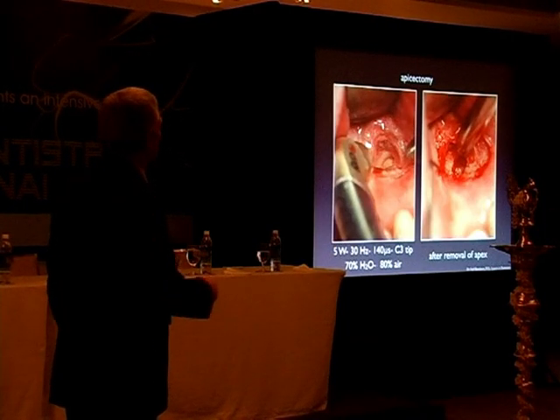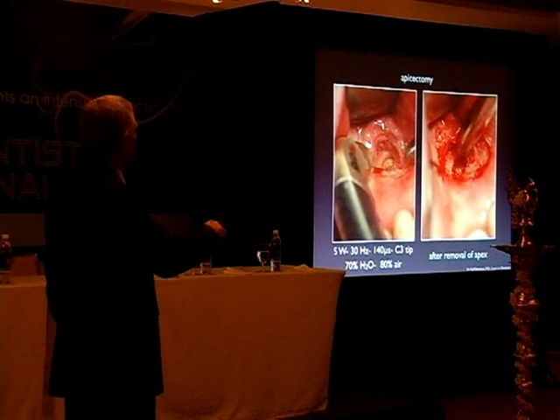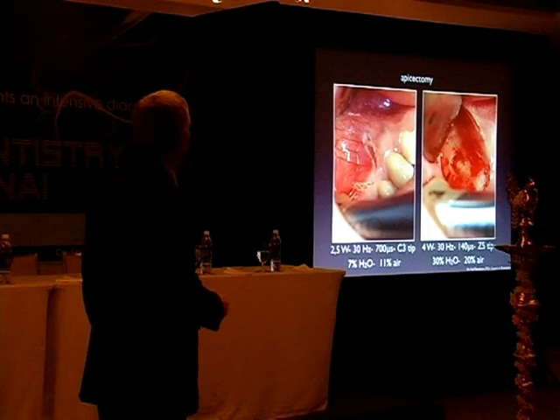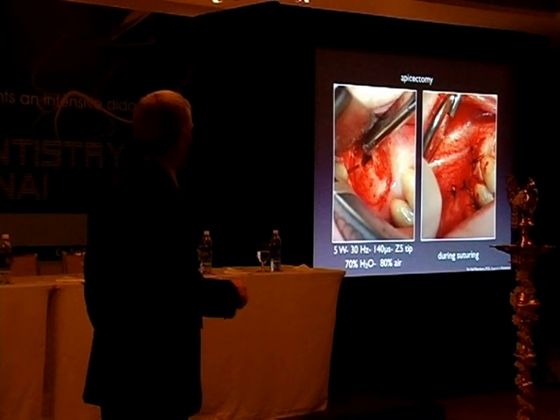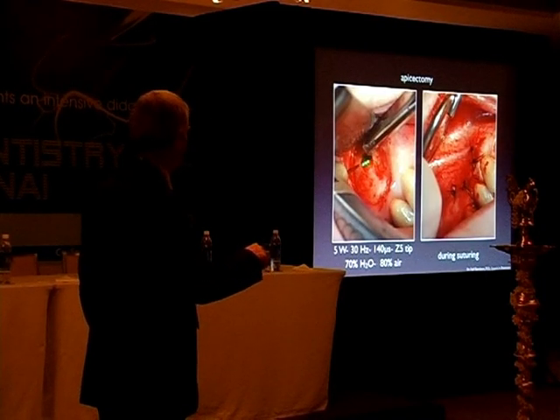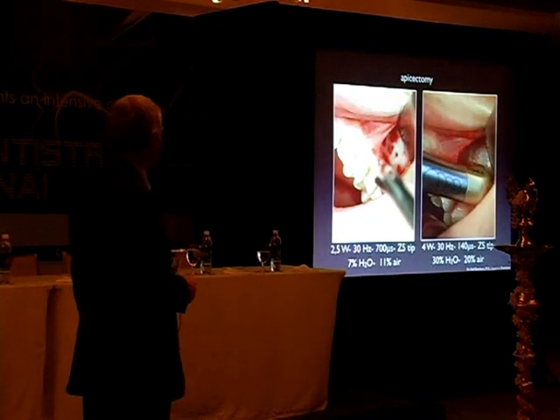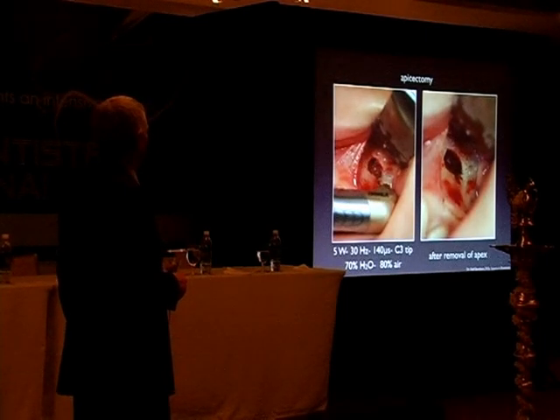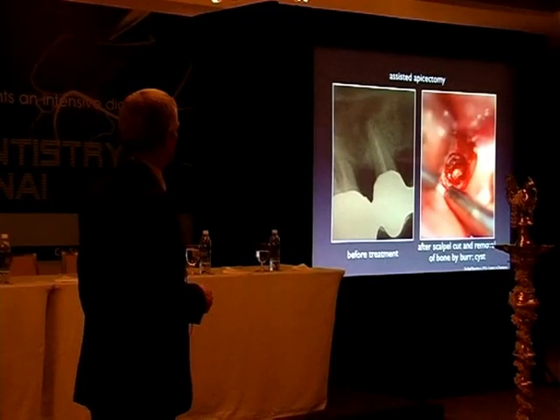Same case again, it's always the same procedure. Here you can see the root very clearly. Same procedure again, and always short pulse for the hard tissues, long pulse for soft tissues. This is the result 3 months after treatment.